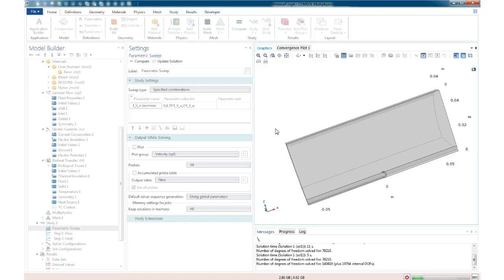But the second is, when I keep it simple like this, and this does encapsulate most aspects of the physics, then the physics takes front and center. I never wonder whether some effect I'm seeing is due to some really strange piece of geometry that I took the trouble to simulate. So in this particular case, even my electrode is very simple, but it does allow me to study the physics, which is heating by the injection of current.